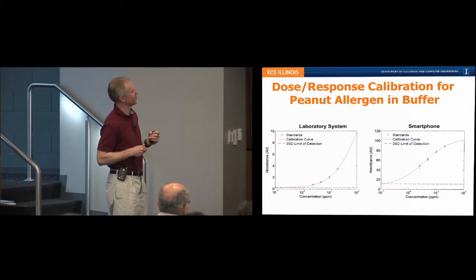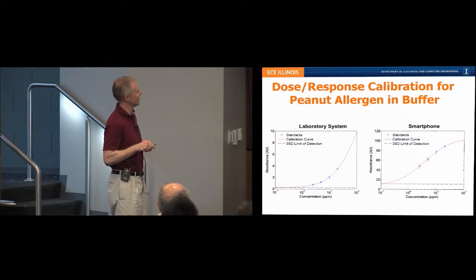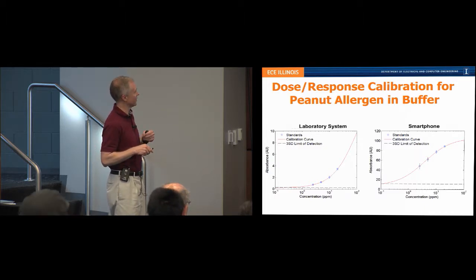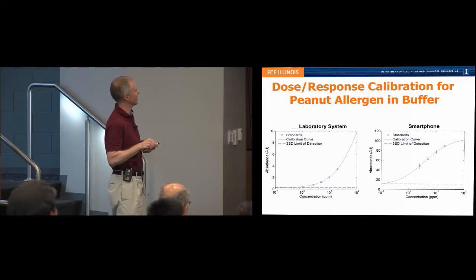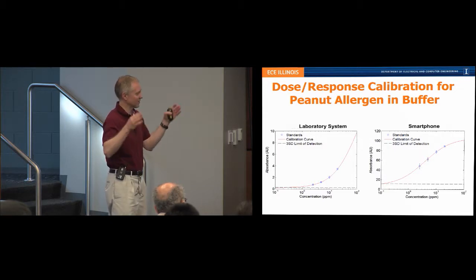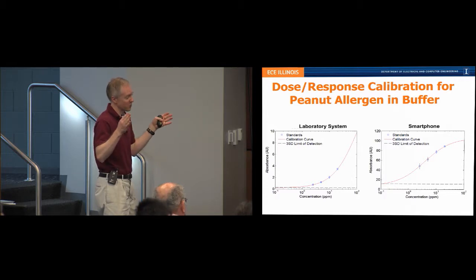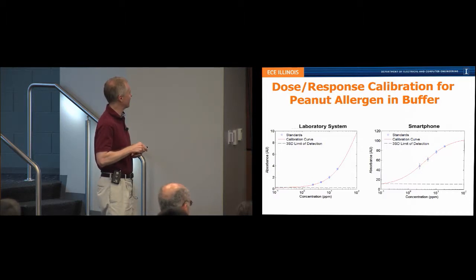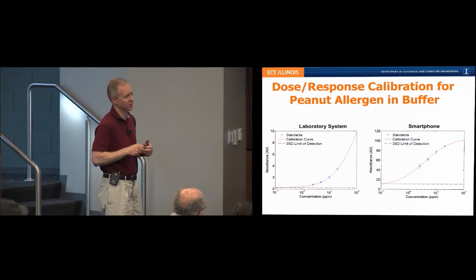When you go in and perform the test, the first thing that we do is put the peanut allergen into the test sample and measure it at 4 different concentrations where we know the concentration. These curves represent the different concentrations. Then we just fit this to a line. What we really care about is that there's some difference between these concentrations that represents the range that we're interested in for diagnosing or measuring the peanut allergen concentration from an unknown sample. As long as we have a difference between the low and high, we're in pretty good shape. We fit this with a curve so that we can interpolate between the points.